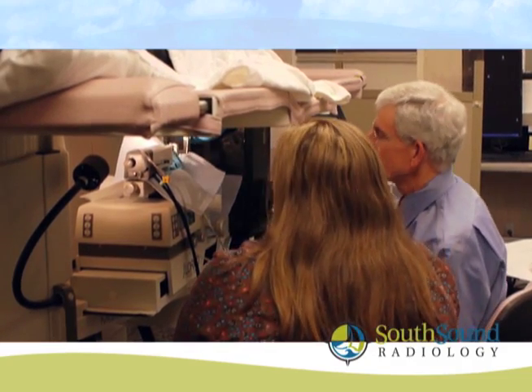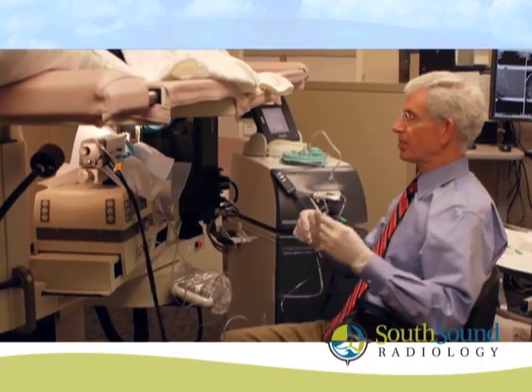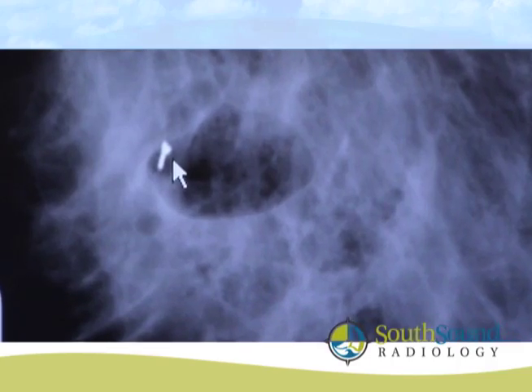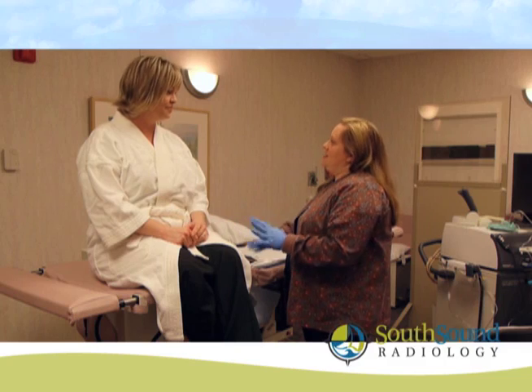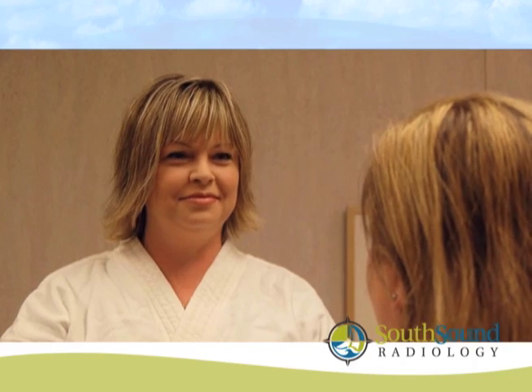A number of breast tissue specimens are obtained through the needle. An internal tissue marker is placed at the biopsy site to mark this area for future reference. The specimens will be sent to the pathologist for diagnosis. When the procedure is finished, a small protective bandage is placed over the biopsy site.